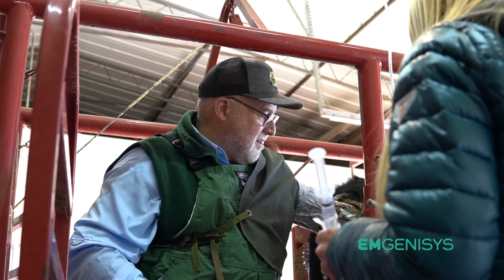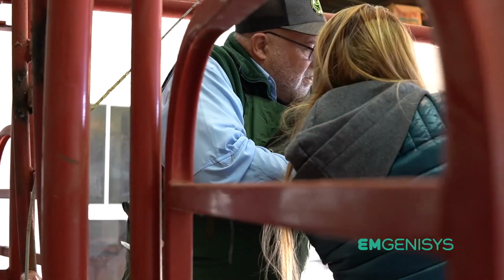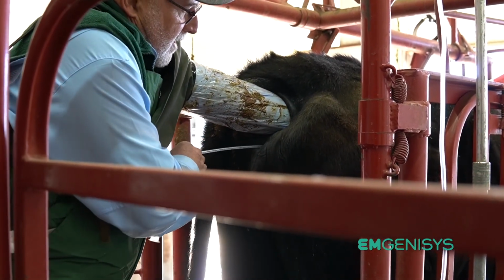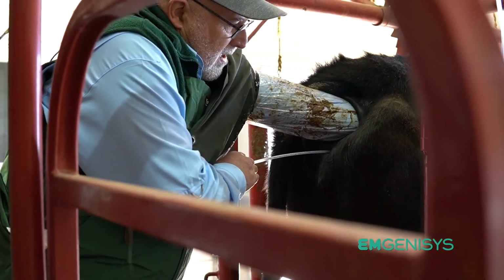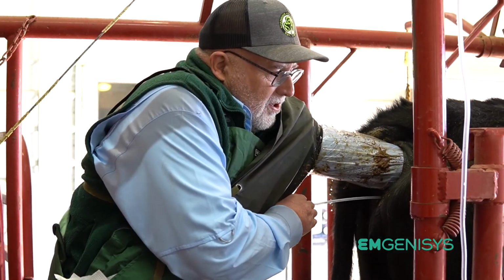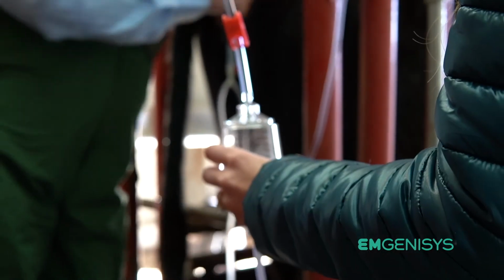Dr. Killingsworth can access each horn by inserting one hand into the rectum and then feeling through the rectal wall to identify the reproductive structures below. He can physically hold the cervix to guide the catheter through the vagina and cervix to properly seat the catheter in one horn of the uterus. In cattle, this can be tricky because the cervix has annular rings of cartilage, which makes passing a catheter through the cervix into the uterus feel like a labyrinth. However, he can verify the successful insertion by feeling it with his other hand.